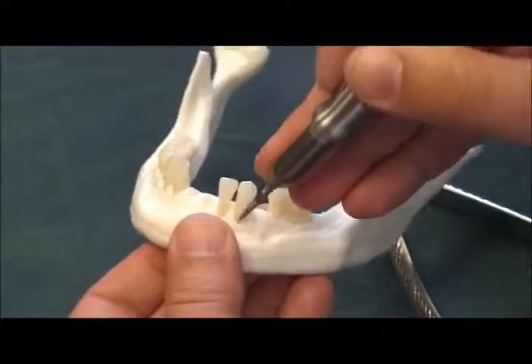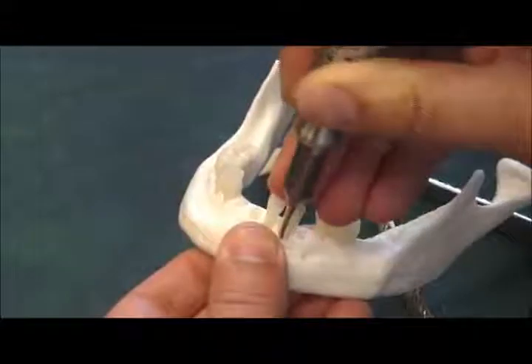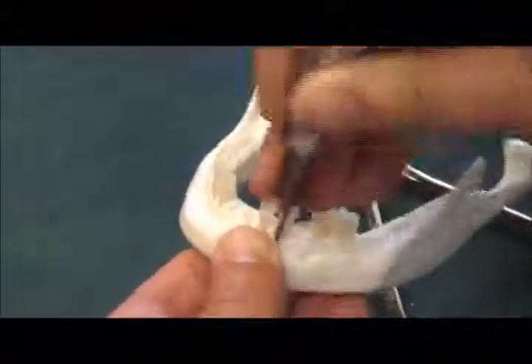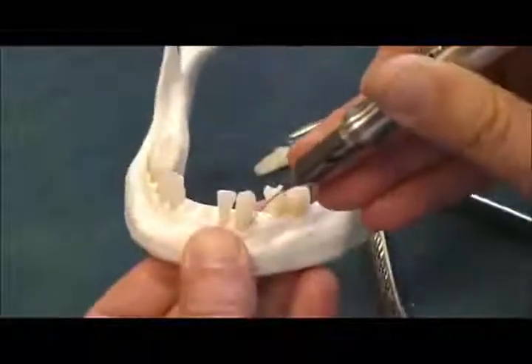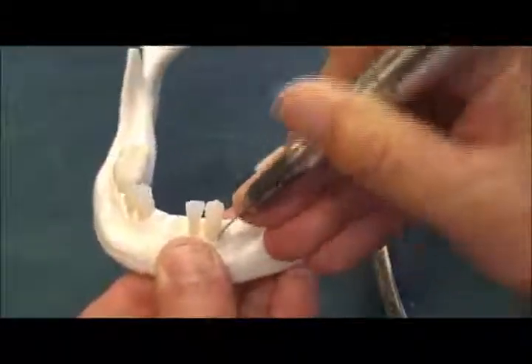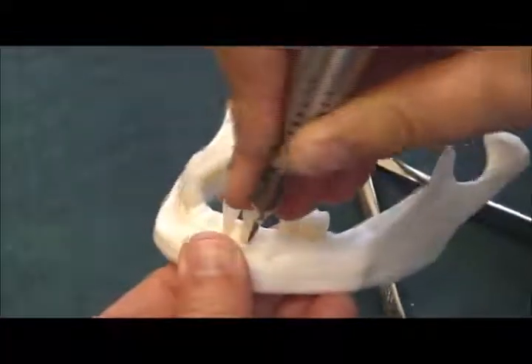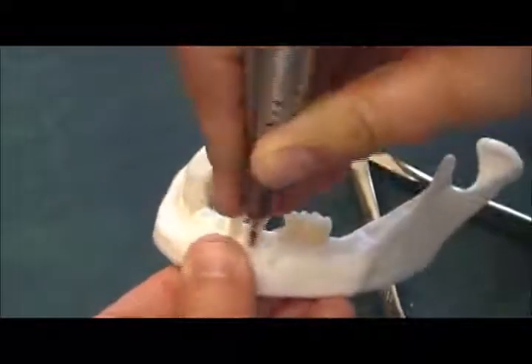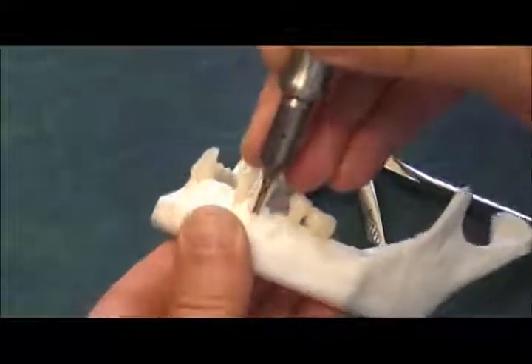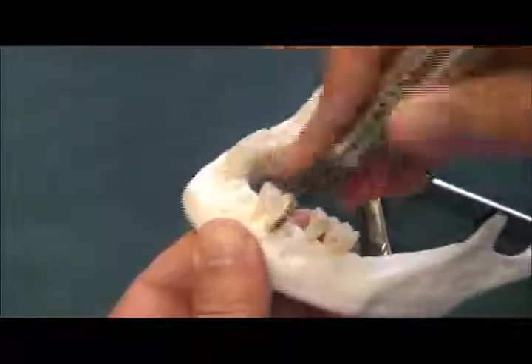So I'm going to come up here on the mesial facial, fairly steep angle, start sweeping over to the facial now, and little by little we're going to loosen this up. I'm going to go on the distal here, again supporting underneath the jaw. There are times when you can adjust, and again you have a lot more leeway when you actually do a full thickness flap. Now that's just buried on the facial there, and that's really good. That goes a long ways to loosening up the tooth.